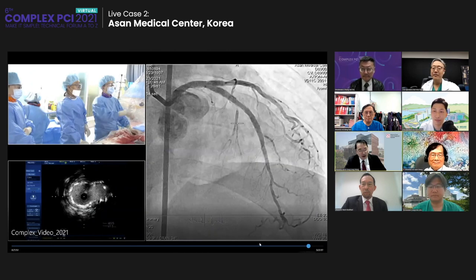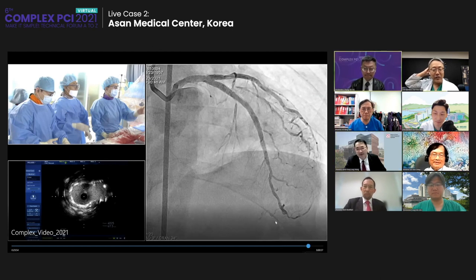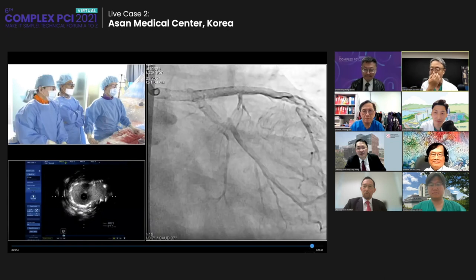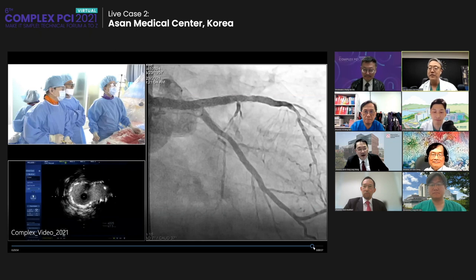Actually, we have the opportunity to have two sirolimus-coated DEB. So if the paclitaxel failed, I would use an alternative, another DCB. Okay, Aaron, do you feel any real clinical difference in clinical efficacy of a paclitaxel versus the sirolimus eluting balloon?